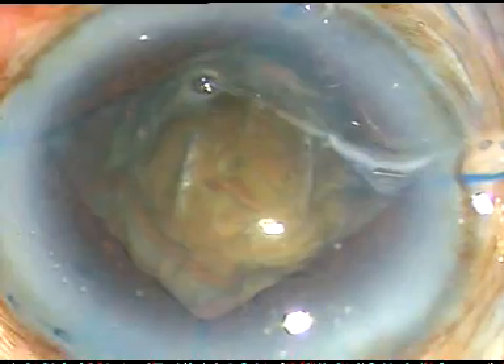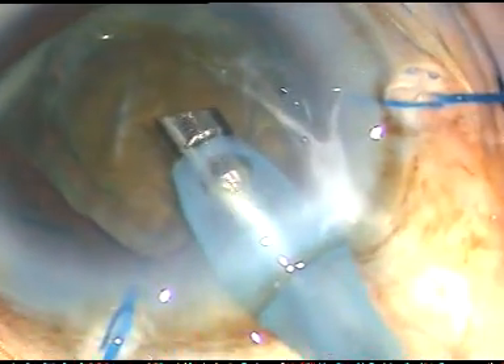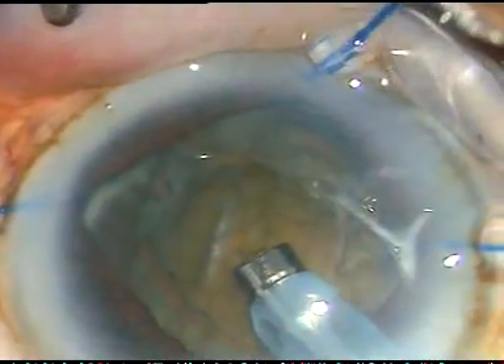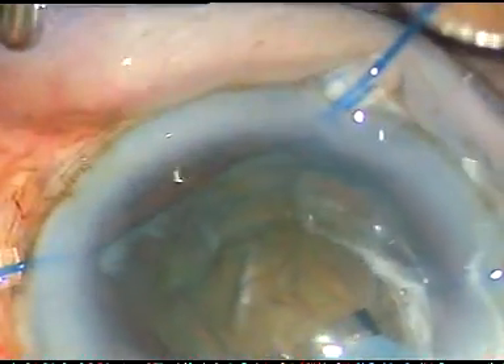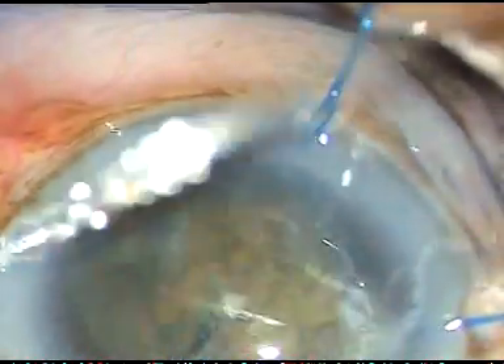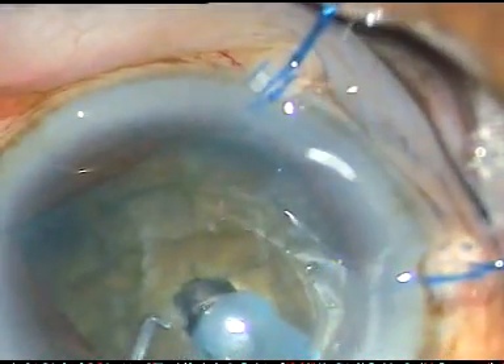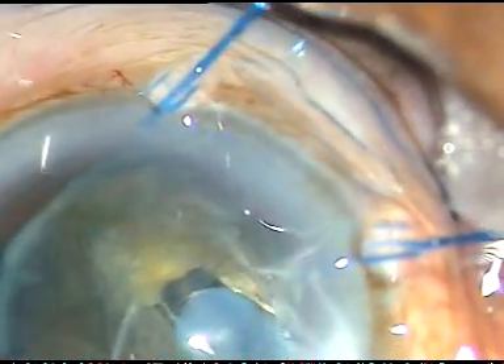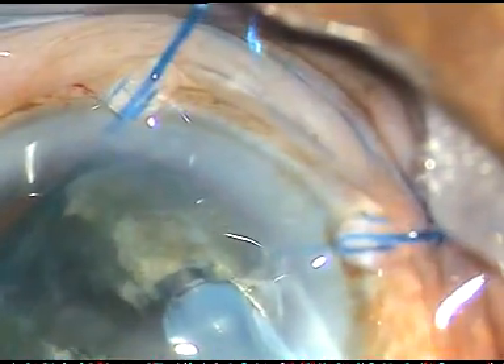When I do chopping and emulsification of the fragments, the bag will be supported and the remaining zonules will not get torn. In this case I am going to do a vertical chop. Just hold the nucleus, bury the phaco tip, bury the chopper very near to the tip, and chop the nucleus anteroposteriorly. This is vertical chop.